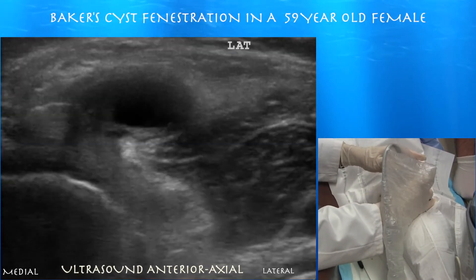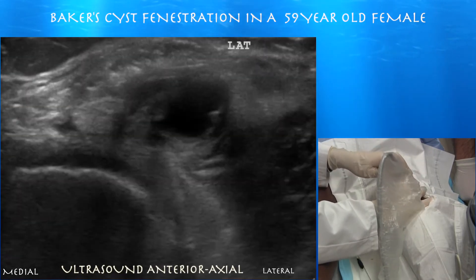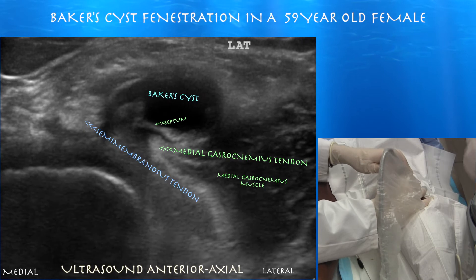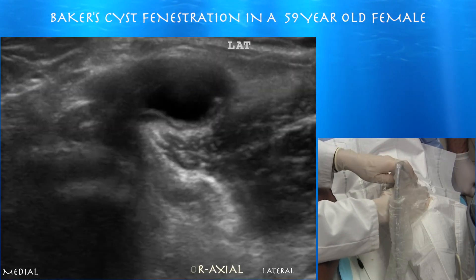Here is this large Baker cyst — right side of the screen is lateral. You can see the Baker cyst between the semimembranosus tendon and the medial gastrocnemius tendon. The semimembranosus tendon appears black from anisotropy. You can also see a septum forming within the cyst.